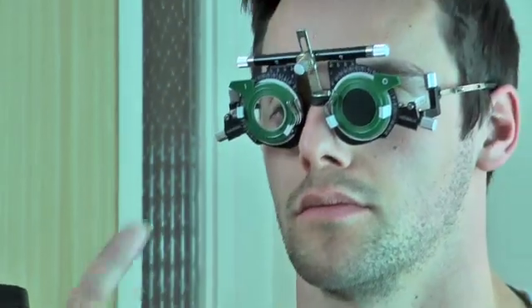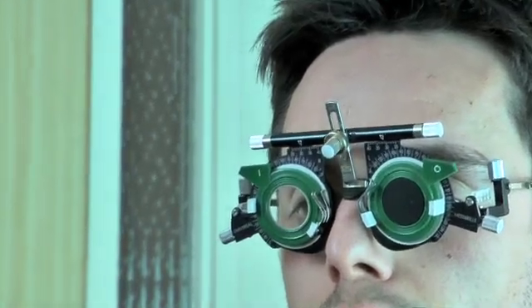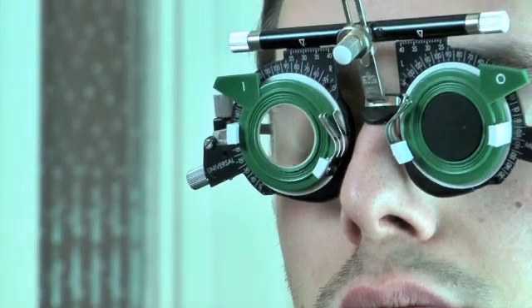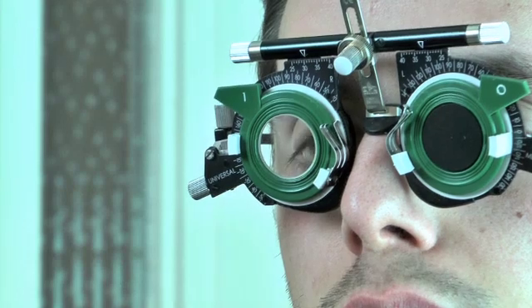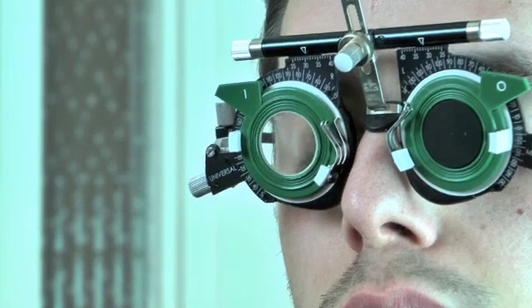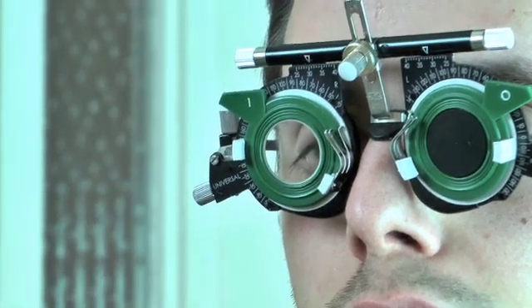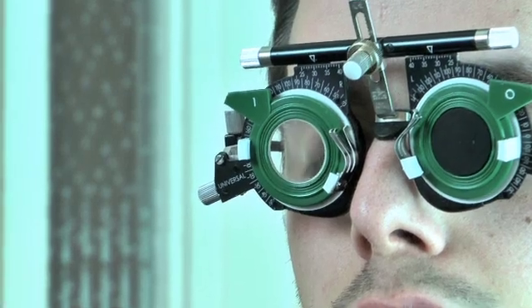And then we ask the patient, does this make it better? Does this make it worse? Or is there no difference? And whatever that patient responds will determine what you do next - whether you add more plus lenses, or whether you remove the plus one and reduce it down, and then start adding minus lenses.